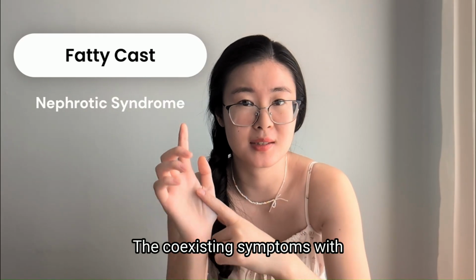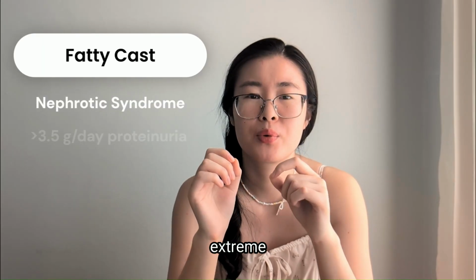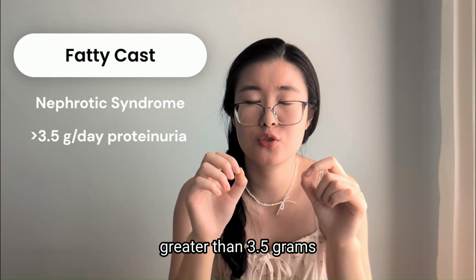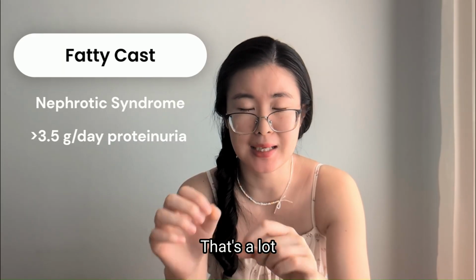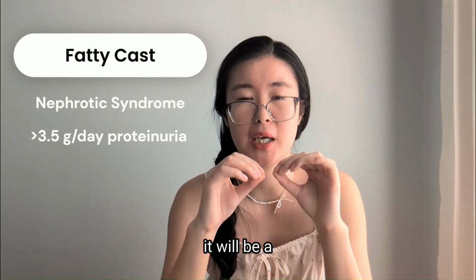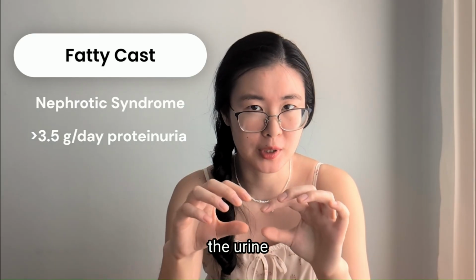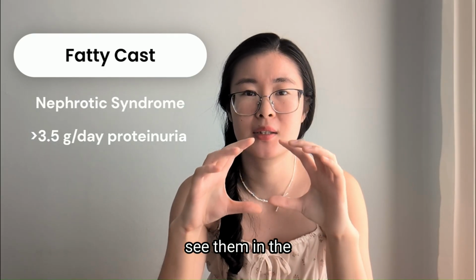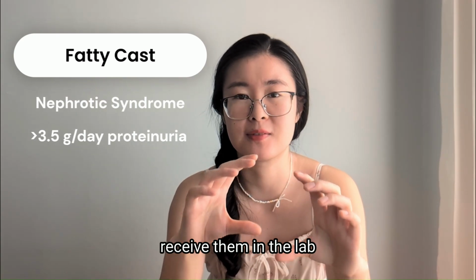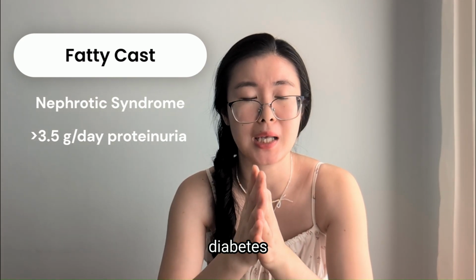The coexisting symptom with fatty cast would be extreme proteinuria, greater than 3.5 grams per day. That's a lot. Every time the patient goes to pee, there will be a huge layer of foam sitting on top of the urine, and you can actually see it in the urine cup when you receive it in the lab. It could be caused by uncontrolled diabetes.